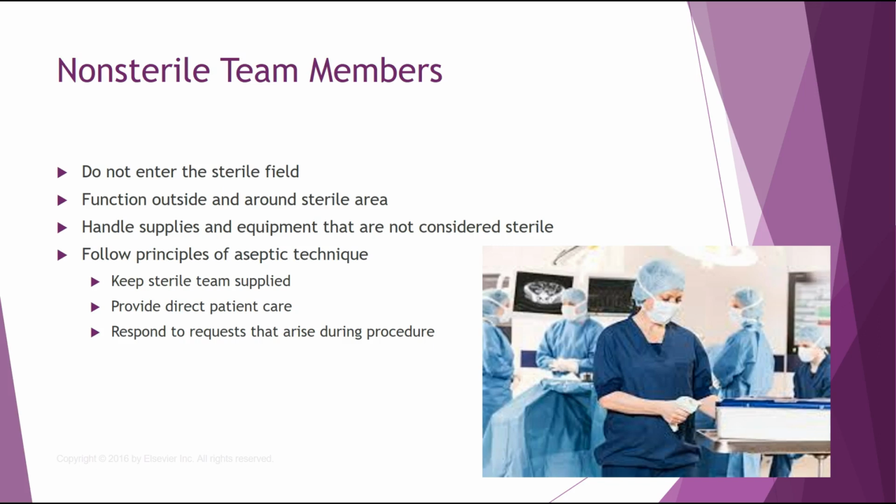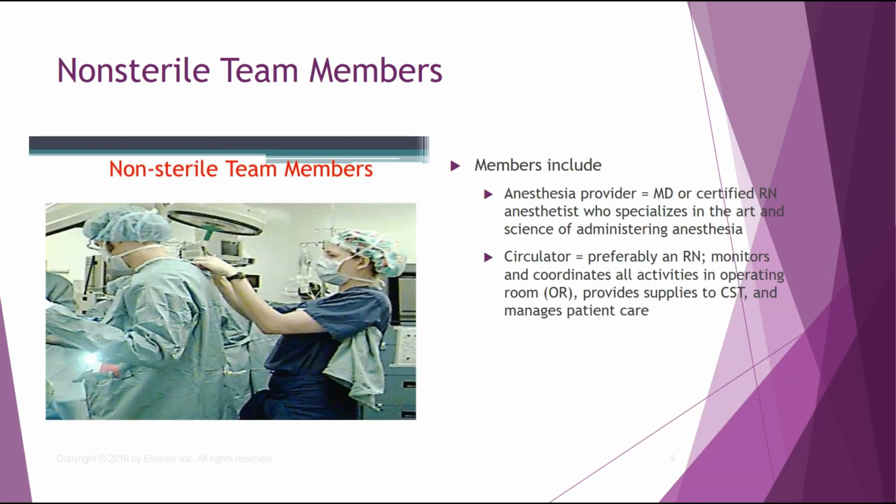Okay, non-sterile team members do not ever enter the sterile field. We are assistants to the sterile team. We, as radiographers, are part of the non-sterile team of an OR suite. The members can consist of the anesthesia provider. So whoever's doing anesthesia, the nurse anesthetist or the anesthesiologist, they are not sterile team members. They are using a lot of equipment.